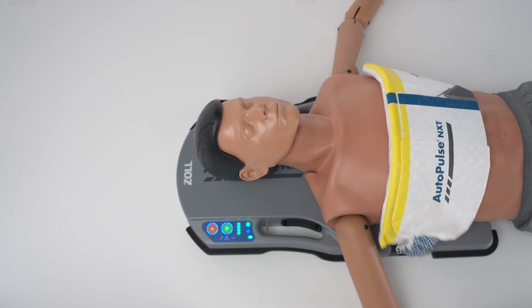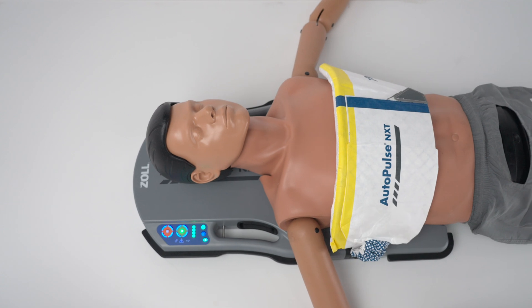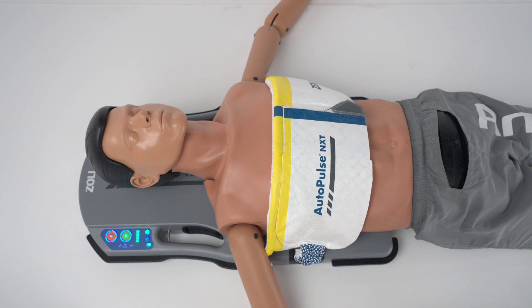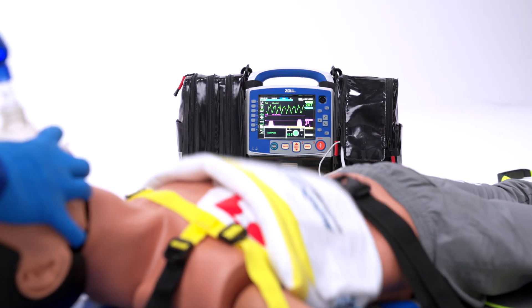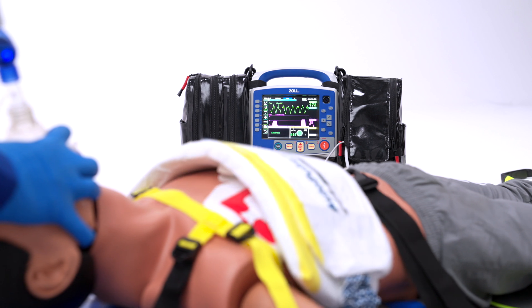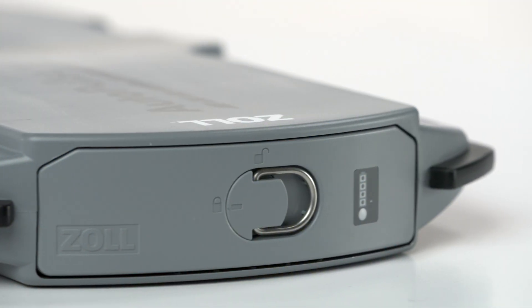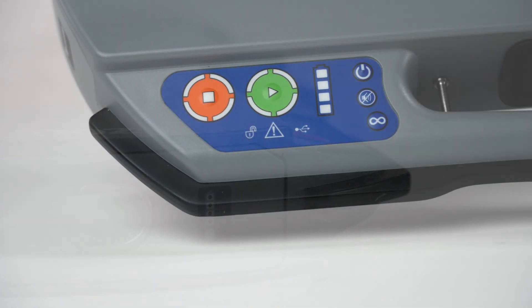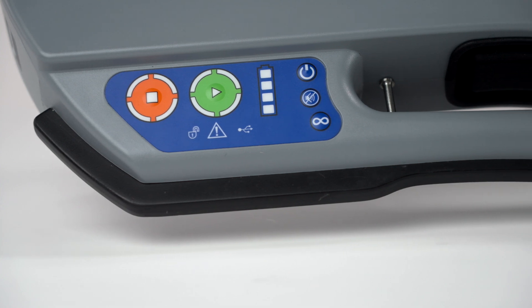The AutoPulse NXT Resuscitation System is a mechanical CPR device that delivers patient-customized, high-quality circumferential compressions that compress the entire thoracic cavity. It is indicated for use as an adjunct to manual CPR on adult patients only in cases of clinical death, as defined by a lack of spontaneous breathing and pulse. The AutoPulse NXT Resuscitation System must only be used in cases where chest compressions are likely to help the patient.